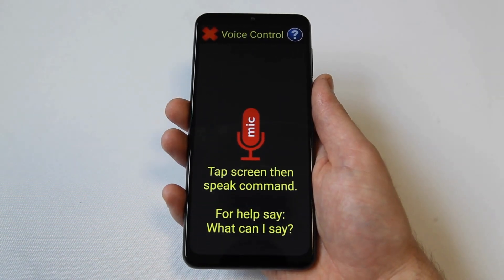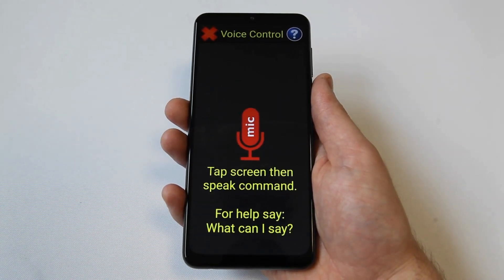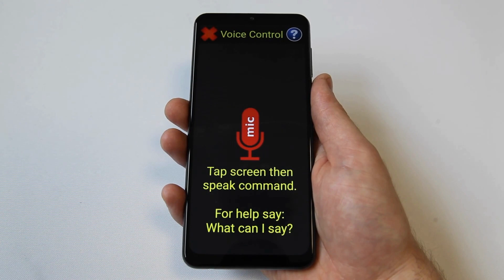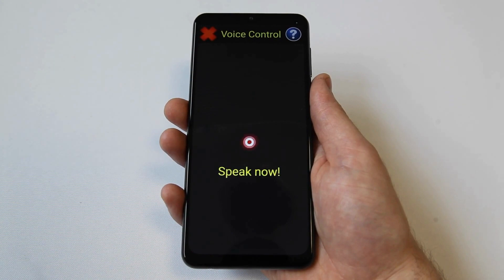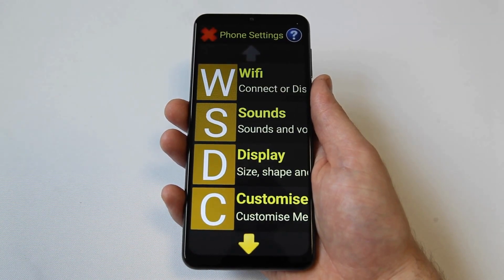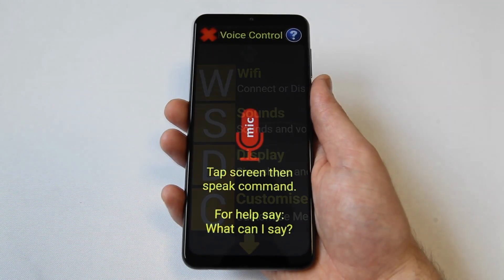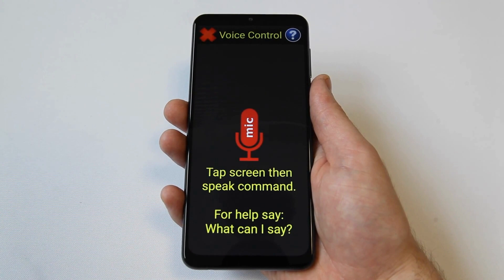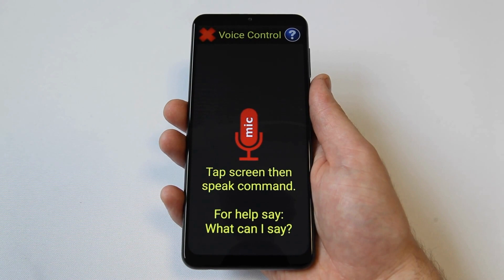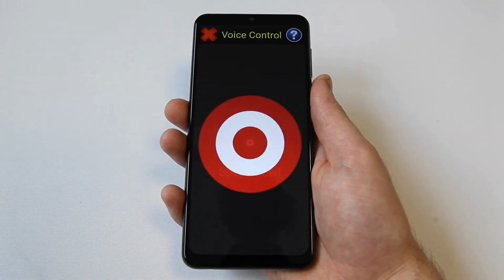Secondly, voice control can be used to navigate Synaptic and other applications on the device. Simply speak any main menu option, such as settings, and the voice control feature will launch this option. Additionally, you can launch any downloaded application by saying the name of the application. For example, you could say iPlayer, YouTube, or WhatsApp to launch these applications.